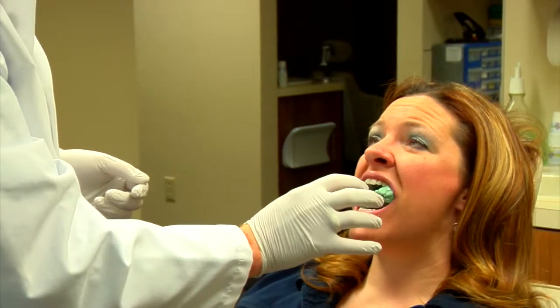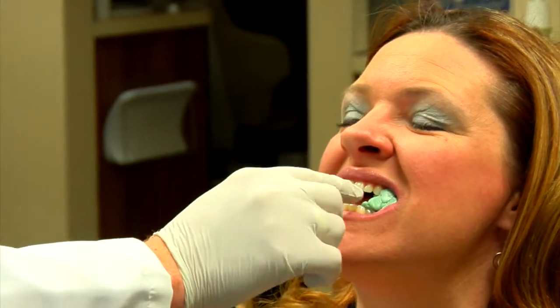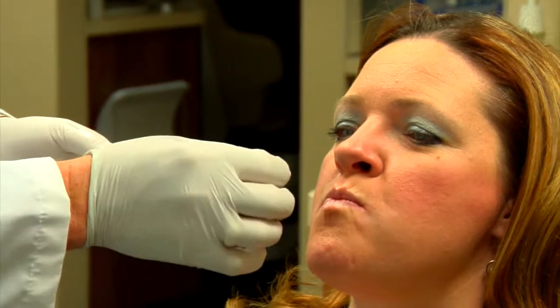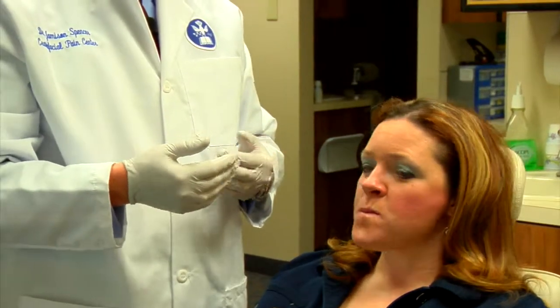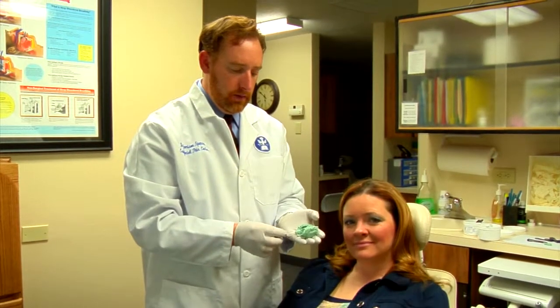All right, and open a little bit. So notice here, close. Good. And the retention there, the tongue can come forward to the teeth. Go ahead and show that. Good. And again, the patient could drink with that in. Go ahead and take that out on your own. Okay, and see if you can put that back in on your own. So easy for the patient to take that in and out of their mouth in a post-surgical setting or at home. So that is fitting the Easy Airway from start to finish, also adding material to make it more retentive, and that is the device from start to finish.